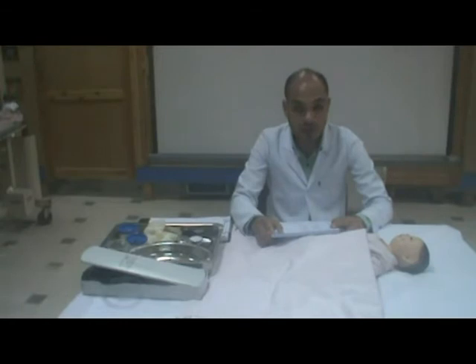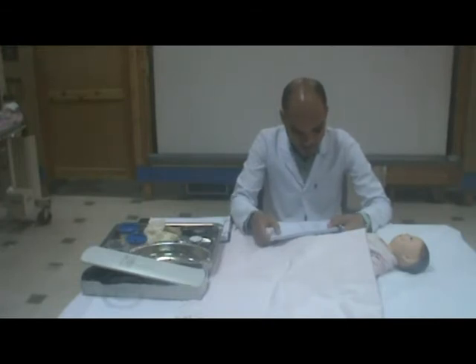Method number 2, oral. The temperature range is from 36.4 to 37.4. Advantages: easily accessible. Replication of thermometer placement is easy. Responds more quickly and regularly to changes in arterial temperature than the rectal method. More aesthetically pleasing.